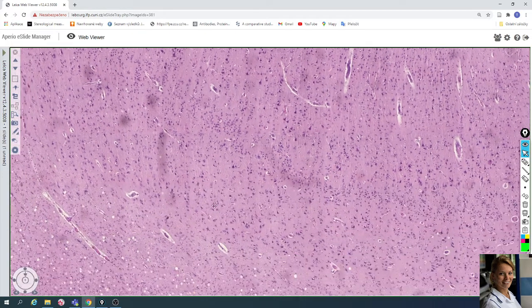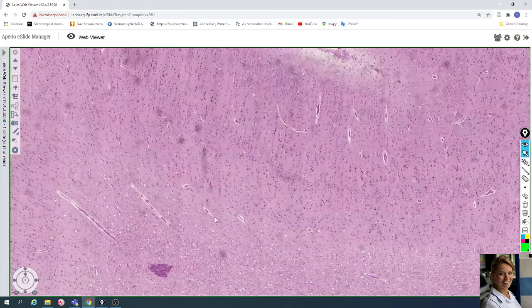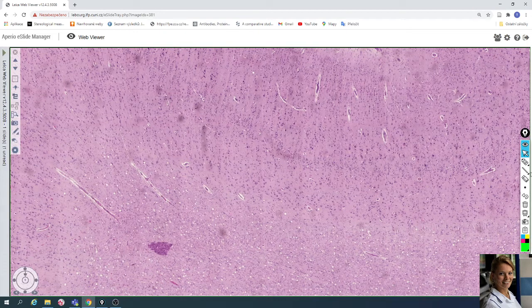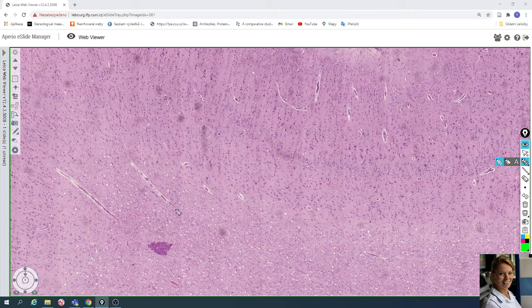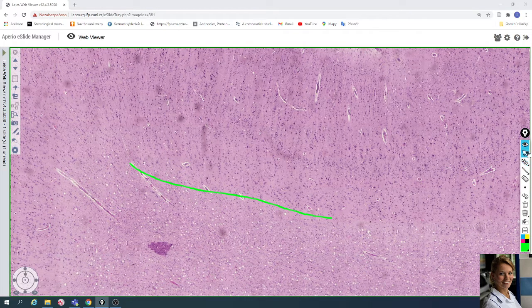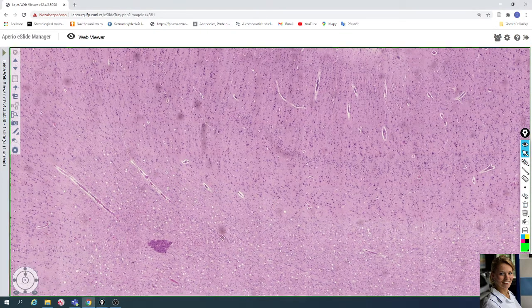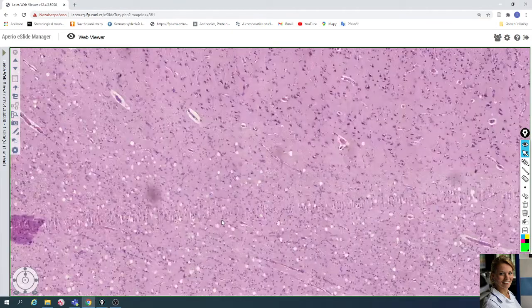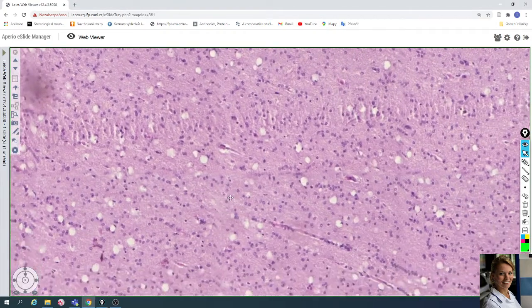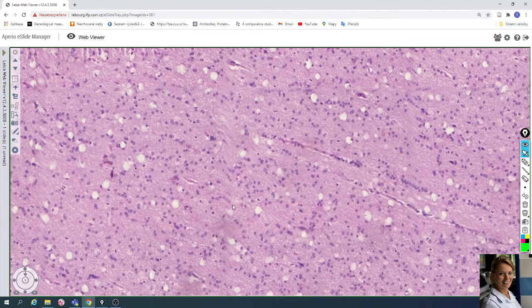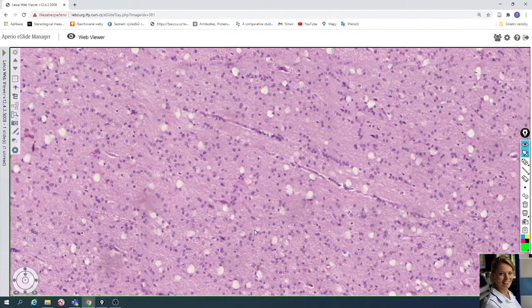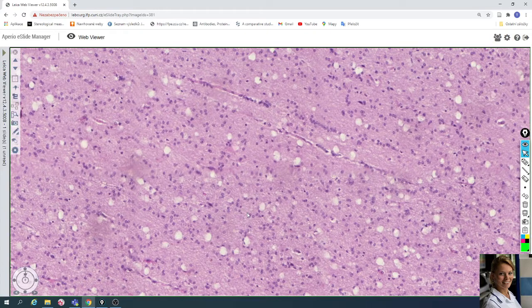Under the gray matter is located white matter. There is not a distinct border between the gray matter and white matter. In the white matter there are predominantly glial cells — we recognize astrocytes, oligodendrocytes, and microglia.